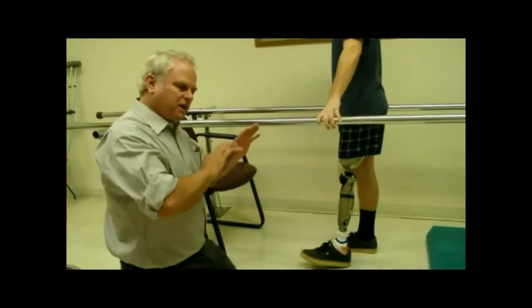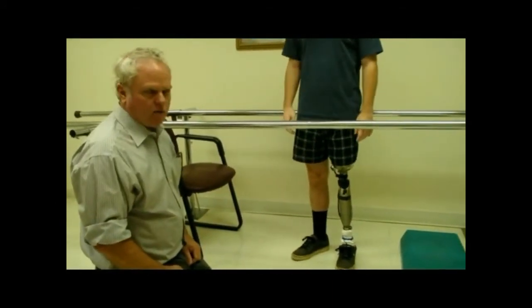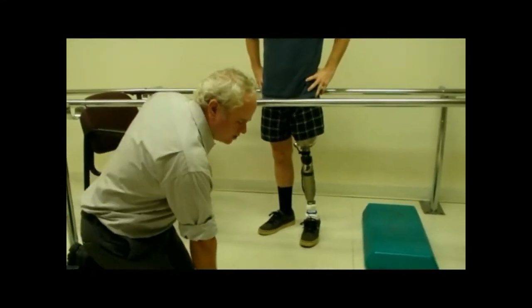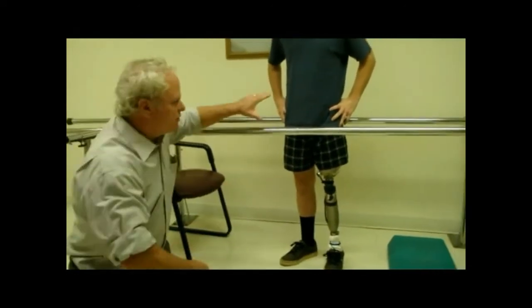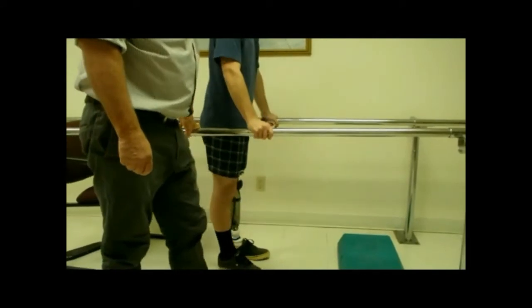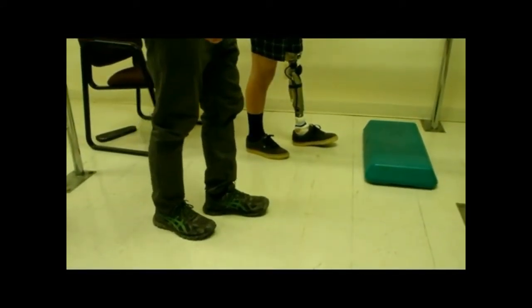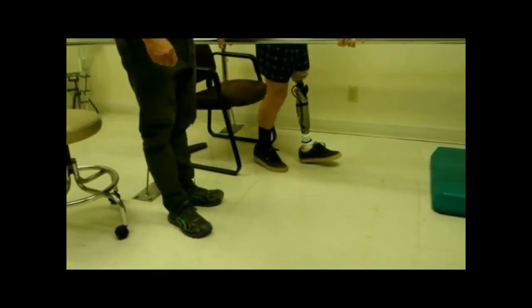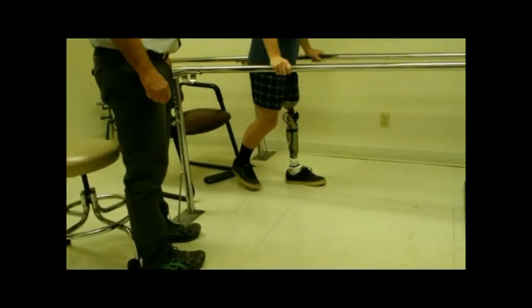So I'm going to take a step back, and I'm going to show you a trick that I'm using a lot now with patients to help them understand how to use yielding, how to trust it, and how to use it. So in the bars, I want you to hold on the bars. I want you to put your prosthetic leg just a little bit in front of you. There you go. That's funny. And I want you to let the knee bend and then take a step backwards with your good foot. Good. Now keep doing that. Try to keep it going.